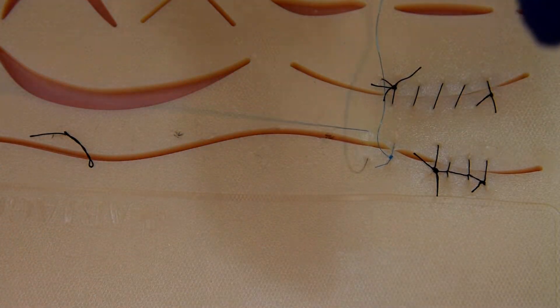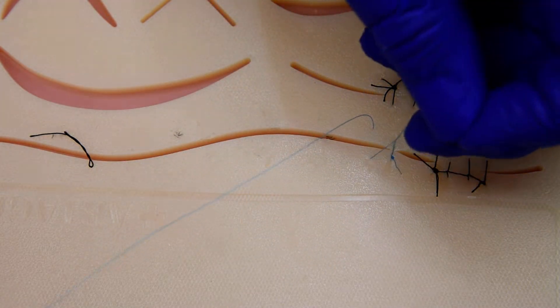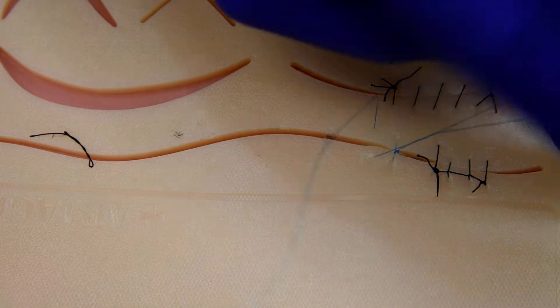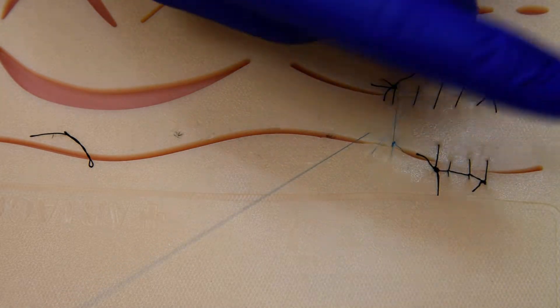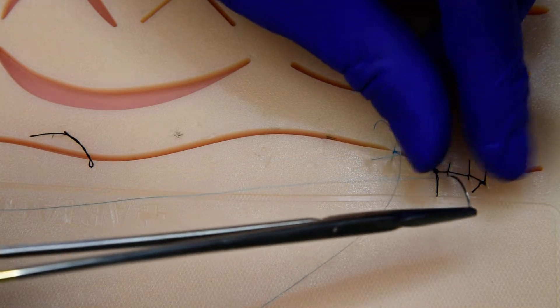Now we're going to leave the loop long. Make sure the loop is not twisted already — here I have an open loop. I'm going to twist it once and twice. So that's the double interlocking, and I'll pass it to myself.